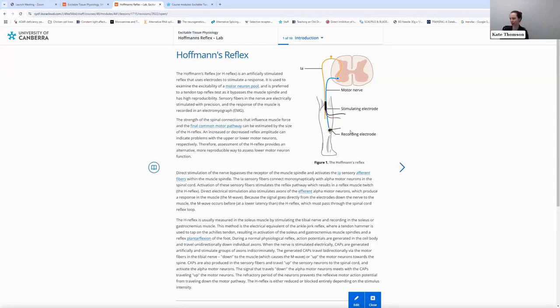The other thing that we had, because we had to get them to do this lying on the floor, we had them placed on just really thin yoga mats, because unfortunately we couldn't have them hanging over tables, because this is also a microbiology lab, so we don't really want them lying on tables. While we had them on these yoga mats, we discovered we were getting quite a bit of electrical feedback in from the floor. We have a robotics lab underneath us, and we seem to be getting a fair bit of machine feedback. So what we had to do is just go into the PowerLab setup file and apply a bandpass filter to filter out the feedback we were getting from that. But then after that, it worked quite well.